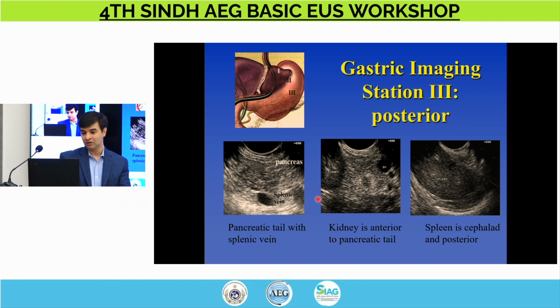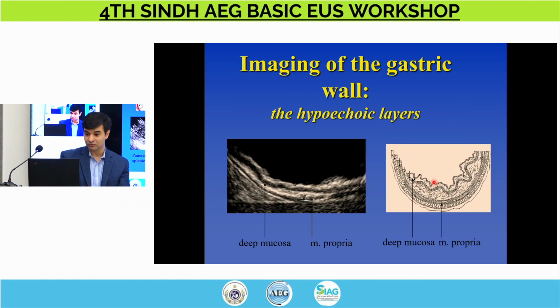This is what the typical appearance of the spleen looks like, and unlike the liver, it's uniform, with a salt and pepper appearance also, and you don't see biliary radicals within it. You may see some blood vessels, but you don't see any bile ducts, and that's how you tell the difference. Sometimes in patients with splenomegaly, the spleen and the liver can be overlaying each other, so learn to tell the difference between the echo texture of the two.